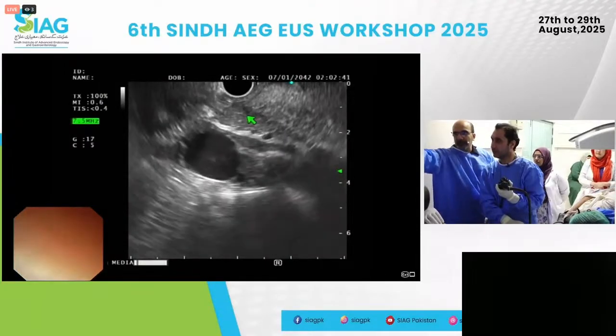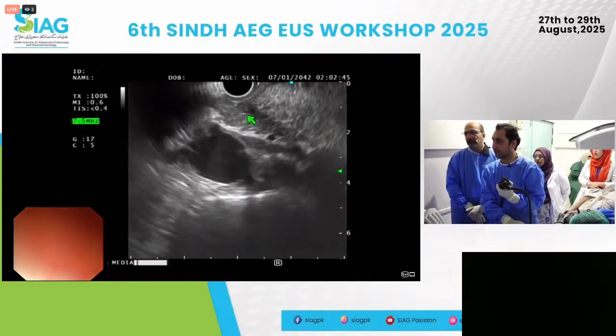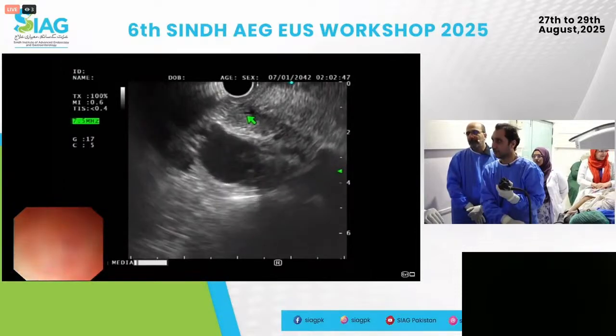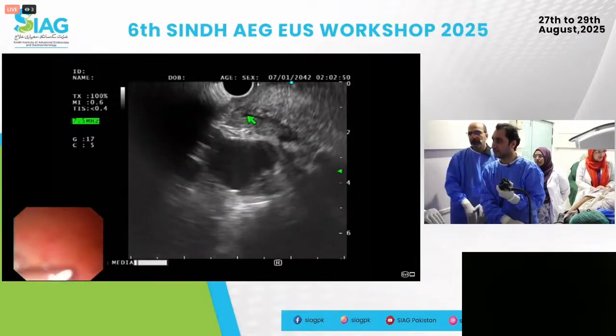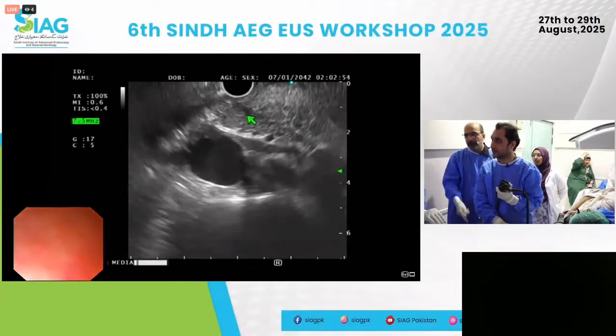So remember, you're compressing it a bit. But if you don't compress, you may fall out. But if you wanted to follow the bile duct, you'd have to keep going counterclockwise. That's the CBD. Yeah, CBD. And if you go clockwise, you'll see the PD.